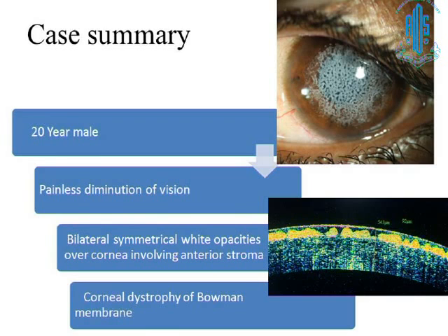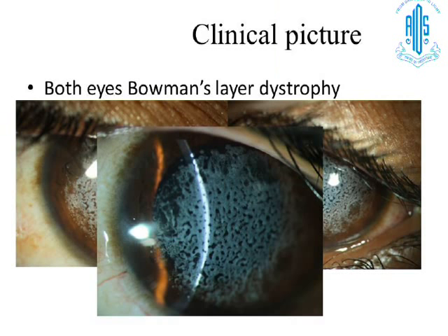Around the same time, a few weeks before this patient, we'd had another similar patient for whom we had tried PTK. In this particular patient, the depth of the opacities clinically as well as with the ASOCT was a little bit deep, about 92 microns, and we felt that just a simple PTK would not help. However, in such a patient, if you want, one can try a PTK first, and if that doesn't clear the opacities adequately, one can even proceed later to any of the surgical techniques.